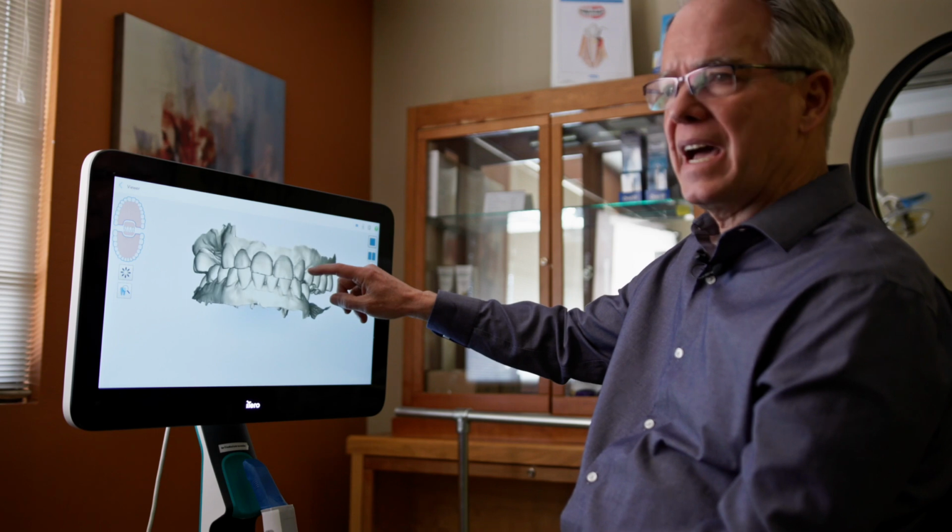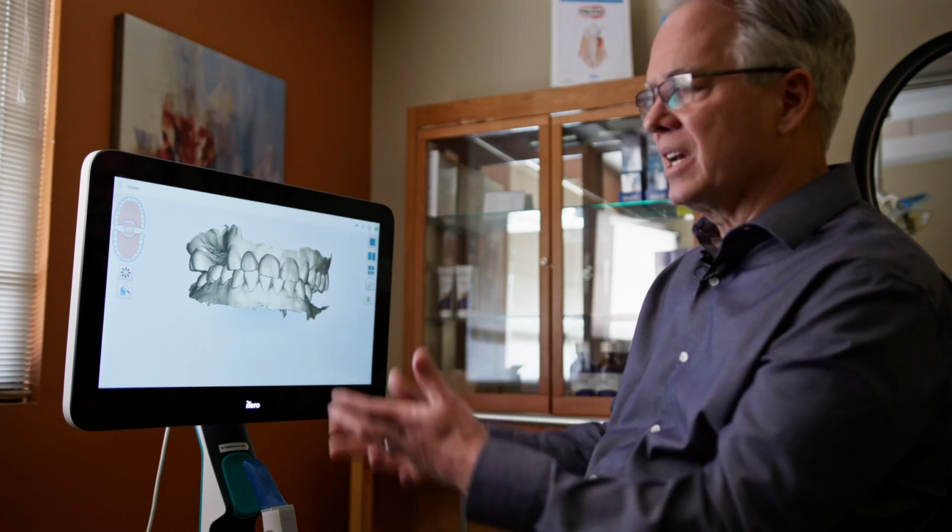Sometimes people get distracted by the color of teeth. They don't really like them, so I can say, you know what, I want to look at the teeth without the color on it. So now they look like models or plaster casts that we have in our hand, and we can see how they fit. What else is really kind of fun?